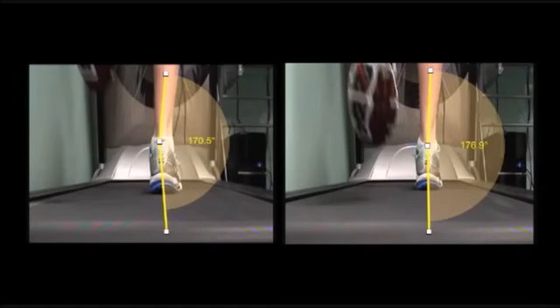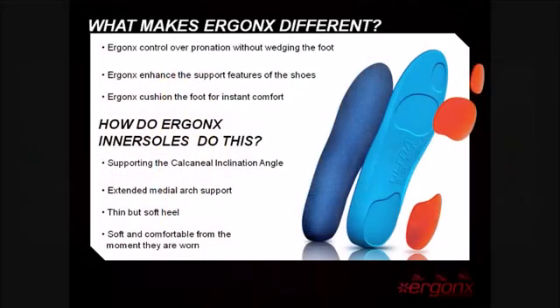Let's take a closer look at our inner soles. The key points of difference are: they control overpronation without wedging the foot; they enhance the support features of the shoe; and they cushion the foot for instant comfort. Our inner soles achieve this by supporting the calcaneal inclination angle, with an extended medial arch support, a thin yet soft heel, and they're soft and comfortable from the moment they're worn.